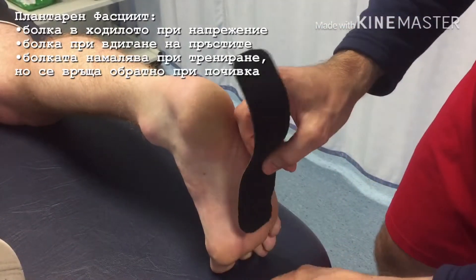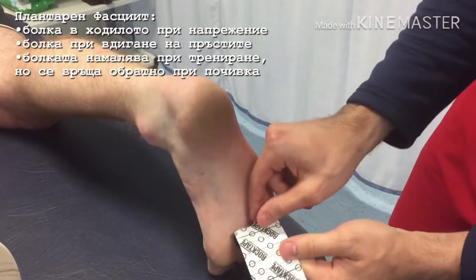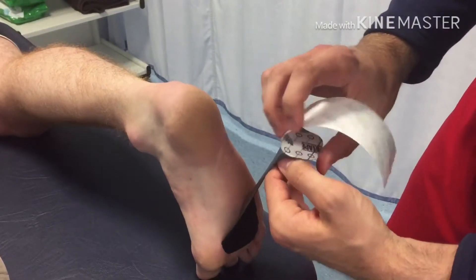Whoop, whoop, just put it in there. 50% stretch applied.